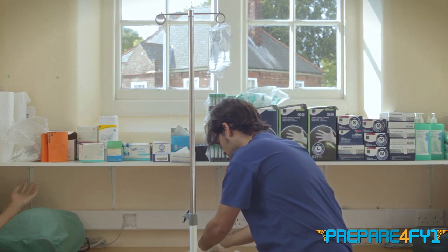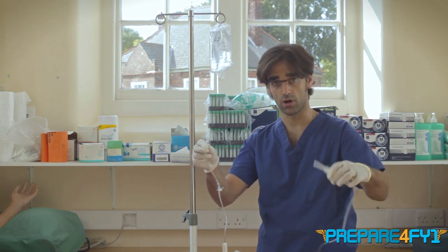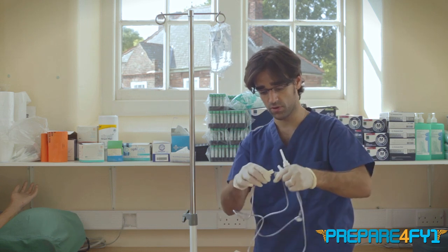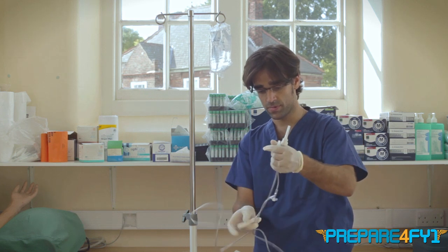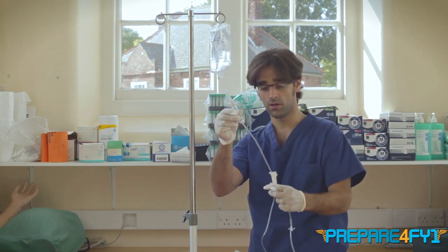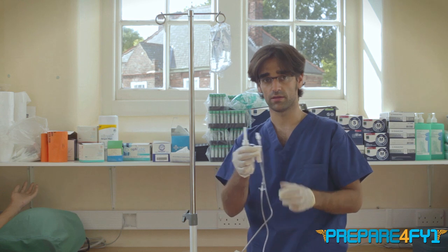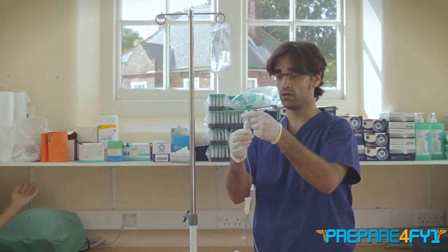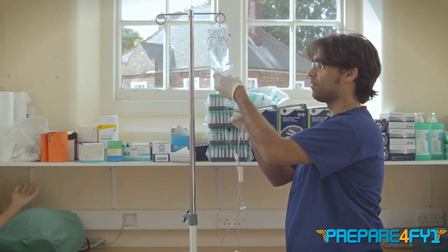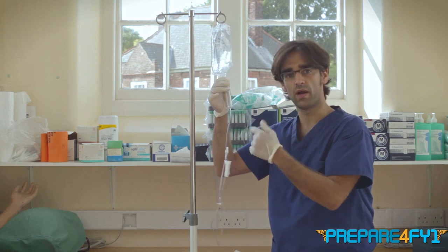When you get the giving set, the wheel to control the fluid is far away from where you're going to spike the bag, so the first thing I'd recommend is to move this wheel up closer to where the spike is. Once you've done that, close the wheel, and you can hold the bag port to keep things neat and manageable. Then remove the cap from the spike and push it firmly all the way through the bag port, being careful not to pierce the bag itself.